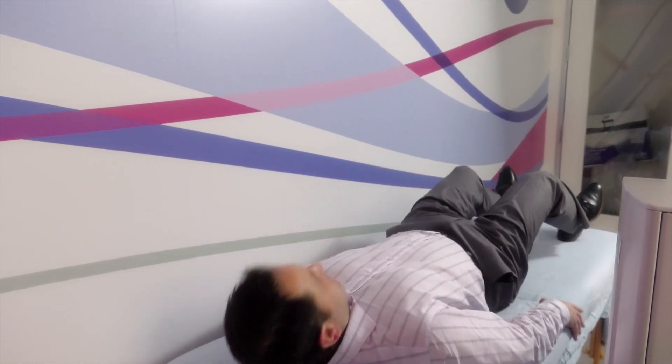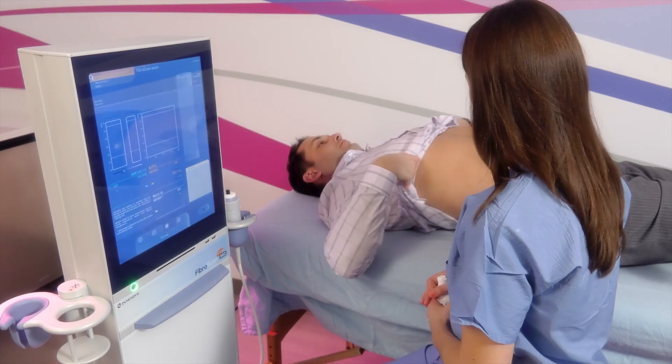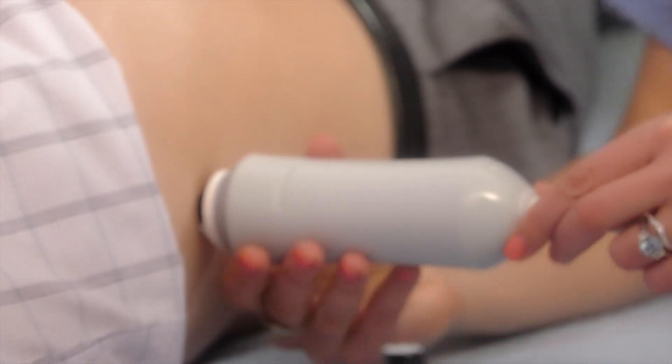The FibroScan operator will have you lie on your back and ask you to raise your right arm behind your head. With your shirt pulled up to expose your ribcage, allow the operator to correctly locate the FibroScan probe. The painless, non-invasive procedure will then begin.